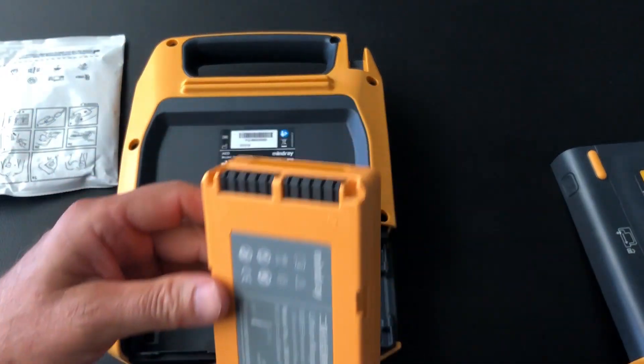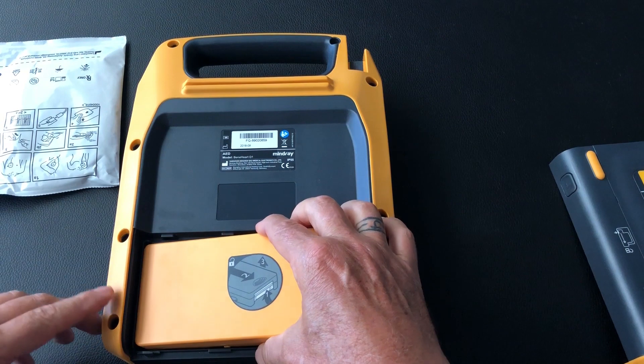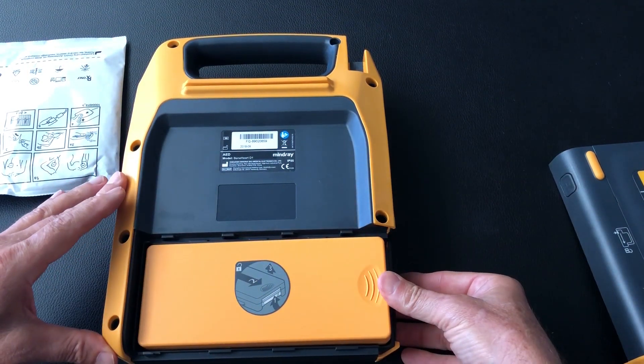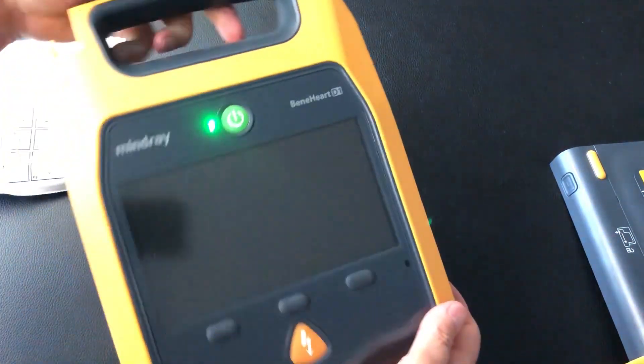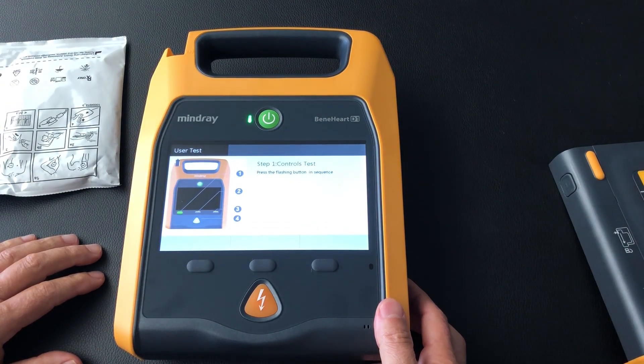So now we grab the battery — these little prongs here go over to the left of the space, so we put it in there and then push it down till it clicks, just like that. Straight away we turn it over and it goes through a test sequence.